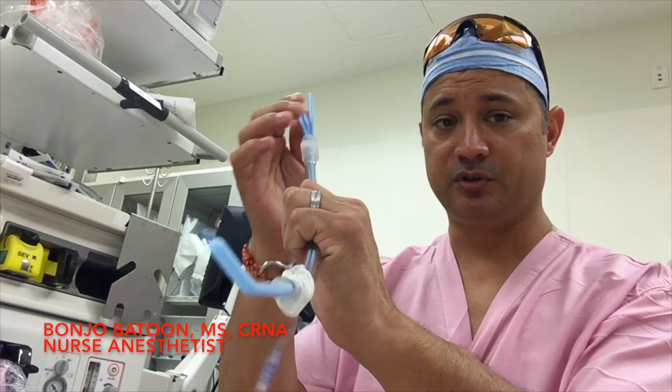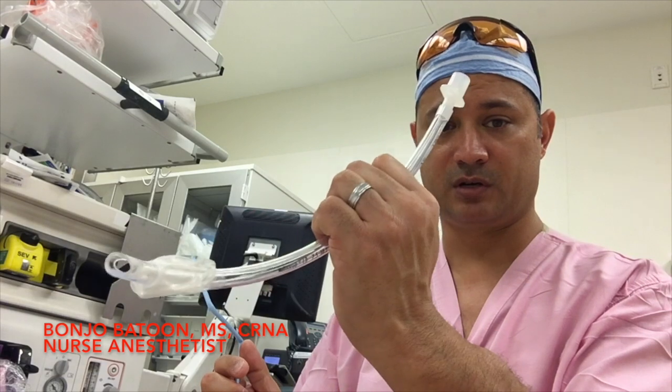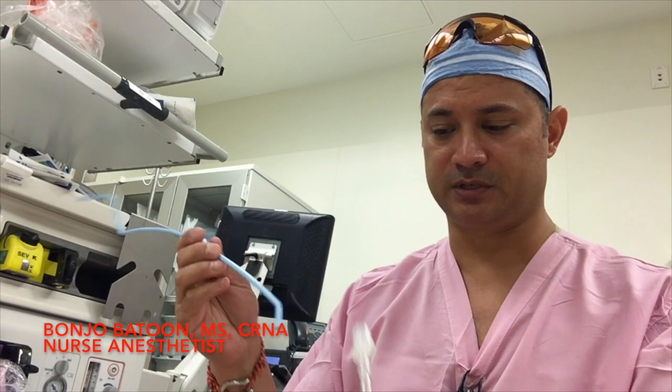In that next motion, you just pull your stylet out, right out just like that. Then you put in your balloon — check end-tidal — and all the other good stuff.